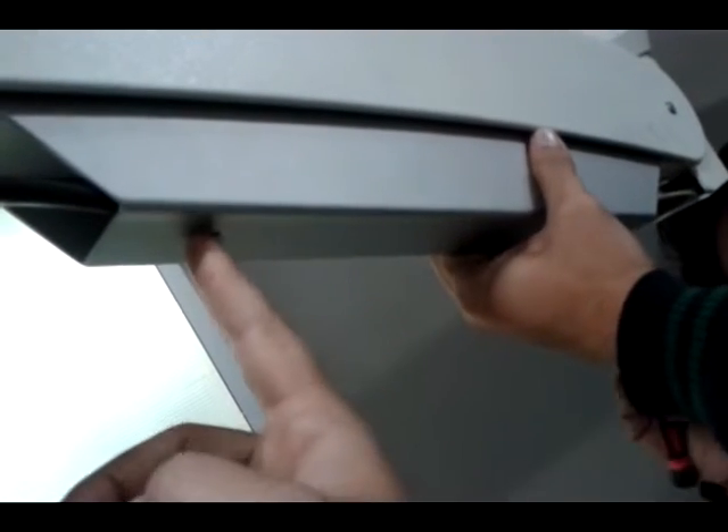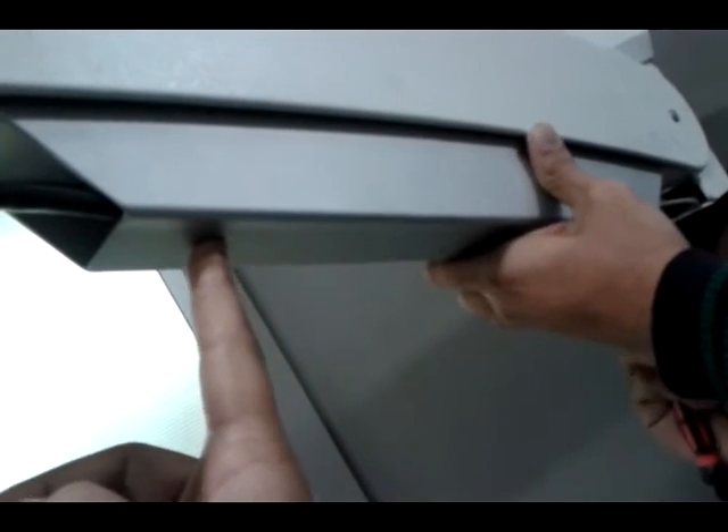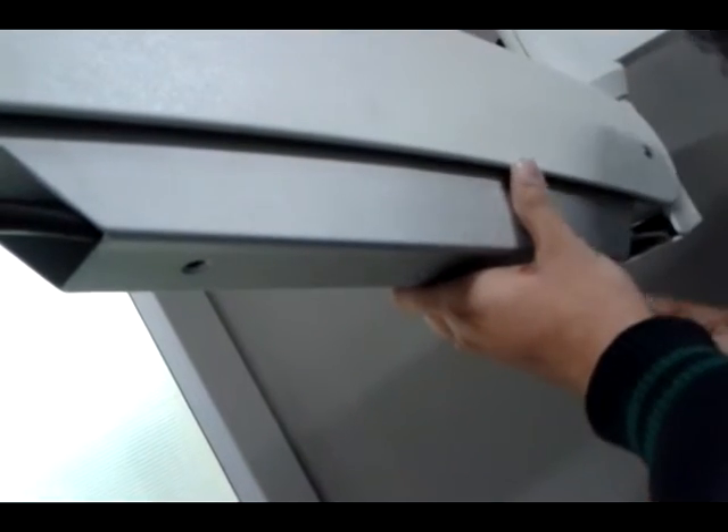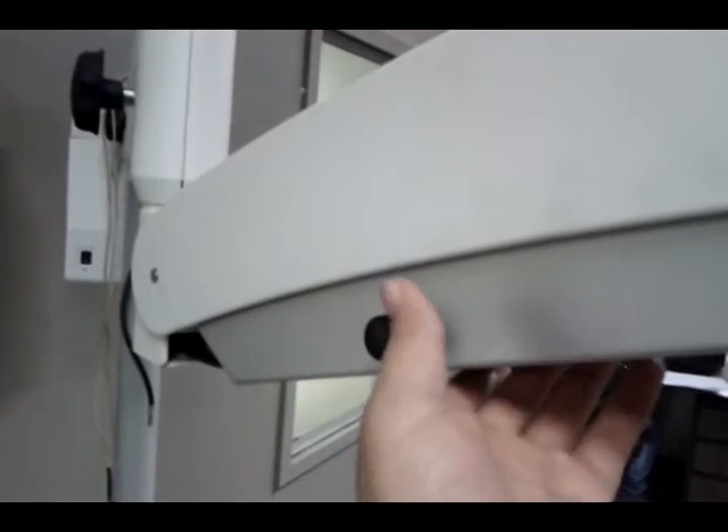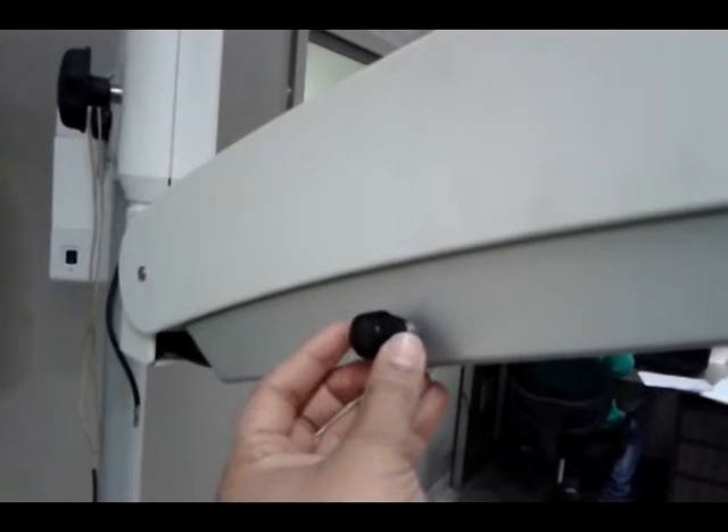Secure these screws on both sides to make it tightened. On the other side of this cover, there is a potentiometer knob situated here.